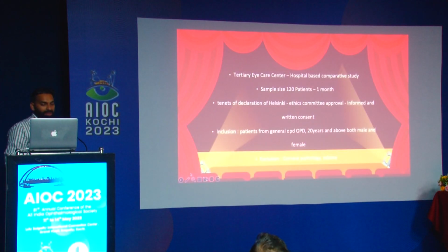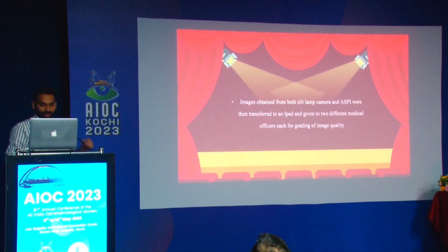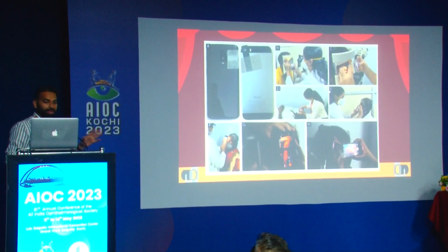We did this in Aravind Hospital, Coimbatore, with 120 patients over a month. It was a very routine examination, the way we do it in the slit lamp, except that we don't use the slit lamp. That's the only thing. So I'll show you the images. This is how we used it.